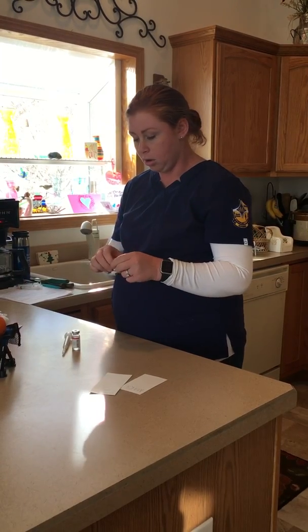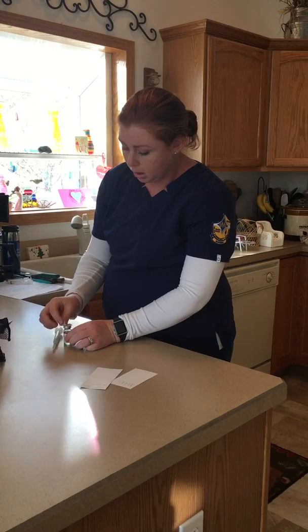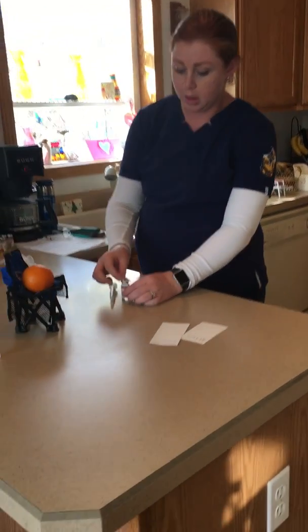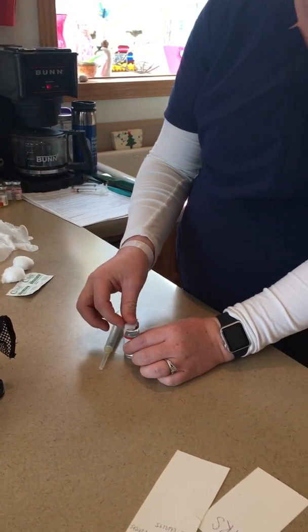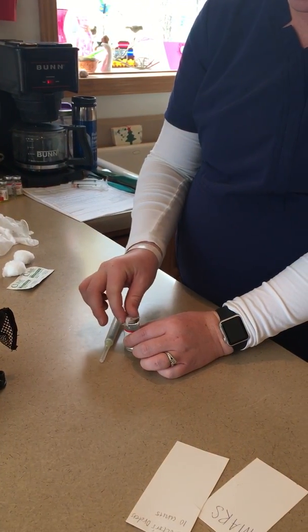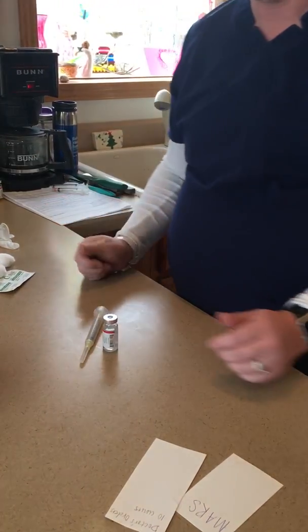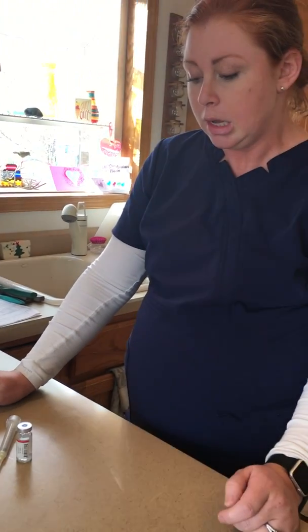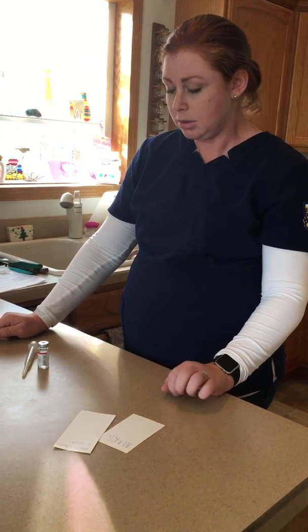I'm going to use an alcohol prep pad to clean the top of my medication vial. Get that really good and clean. While I'm doing that, I can look for any cracks or abnormalities in the vial. This has already been opened once, so I also need to make sure that it's been dated, timed, and initialed by the nurse who opened it, and that it's within a 30-day expiration period.